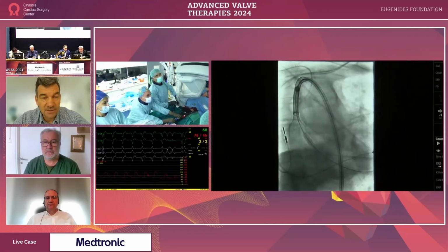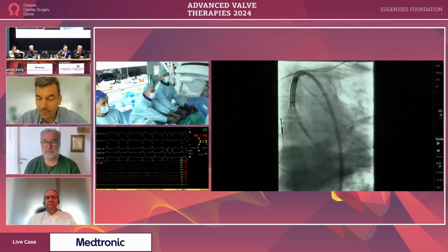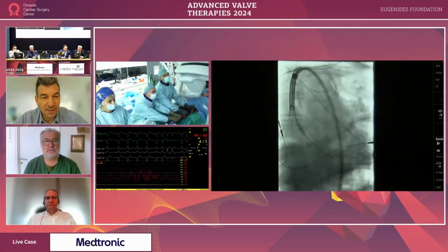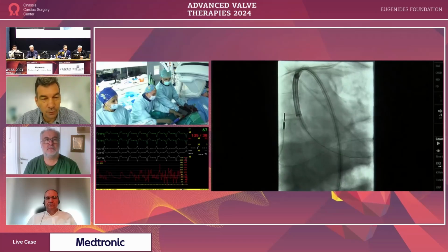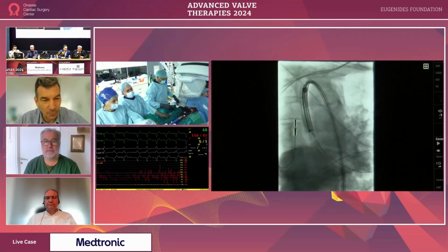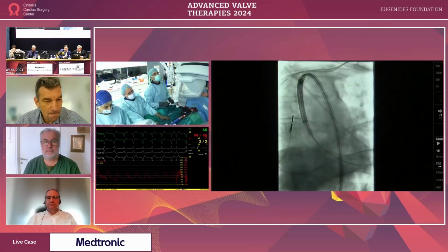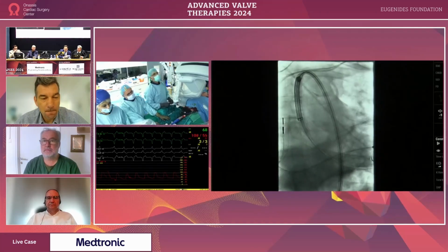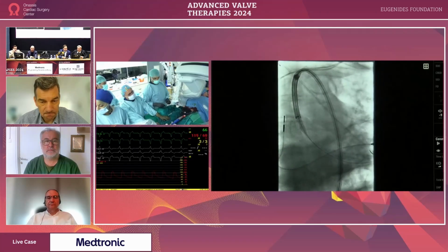Yes, Kostas. My suggestion is to go a bit deeper, high rate of pacing, and change the projection because they have to use the traditional one with the three cusp view. Yeah, maybe. And probably try to pace at the target blood pressure, systolic of 78. Pace faster. Pace to the target systolic. Pace faster, magnify, use dye.